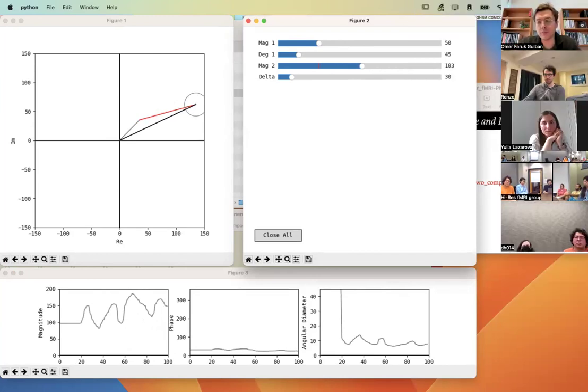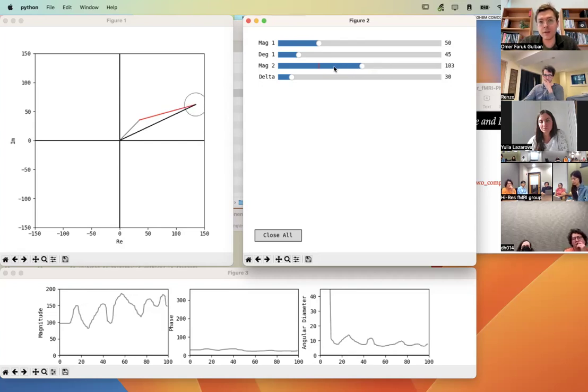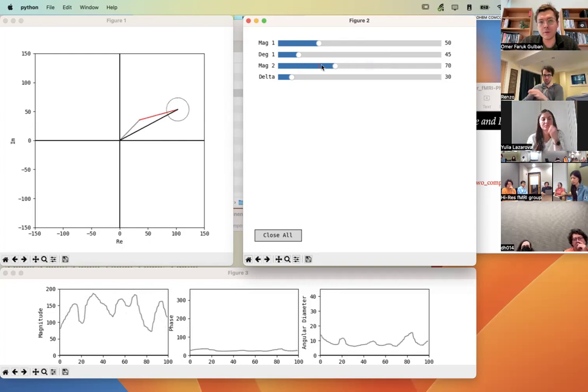And hopefully you can see that this goes to partial volume and a bit in the direction of what Tyler was mentioning. So the amount of different types of tissue in your voxel has an effect on the signal that you measure by itself, both on the magnitude and also the phase of the signal. If I just increase and decrease the red component in a drastic way, I hope that you can see geometrically that not only the length of the black line increases, but also the angle of it changes a little bit, right? So the measured phase changes.